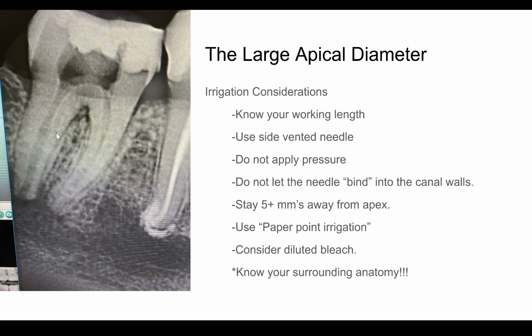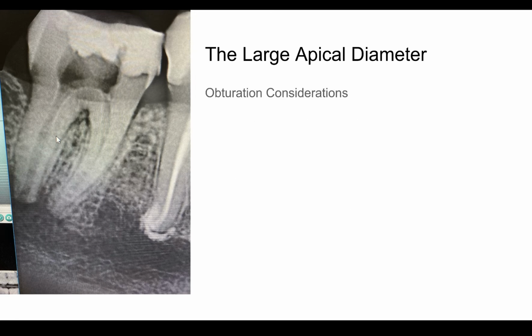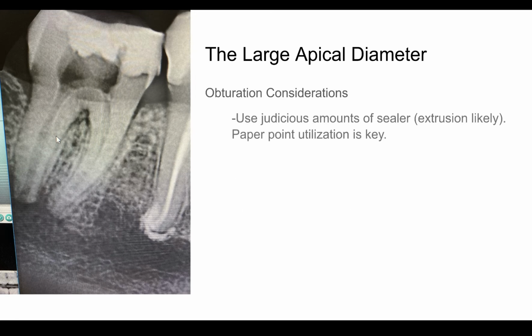And lastly, know your surrounding anatomy. That's a very important theme here I'm trying to drive home. When it comes to obturation, there are a few considerations. Use a judicious amount of sealer.